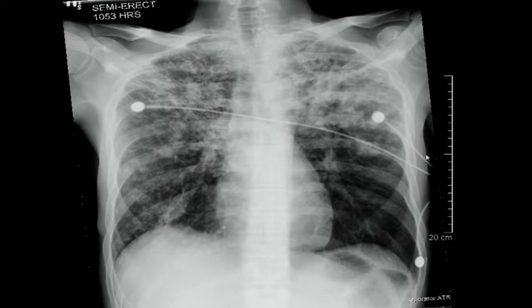What is this sign called? The juxtaphrenic peak, right? The juxtaphrenic peak tells you that when there is tenting or peaking of the diaphragm like that, associated with atelectasis, whenever that happens, the lower lobe is fine but the upper lobe is collapsed. You remember that? Juxtaphrenic peak. It can happen on the right or the left side. It just tells you that the lobe above that is collapsed, there is loss of volume, so it's trying to pull the diaphragm.